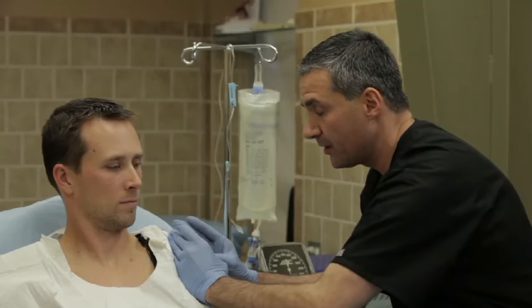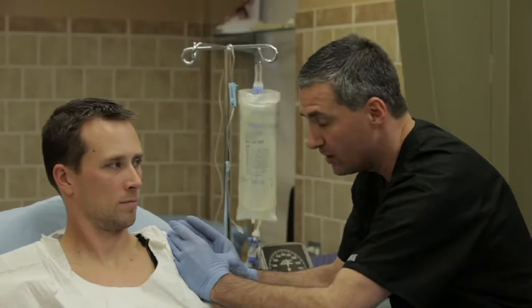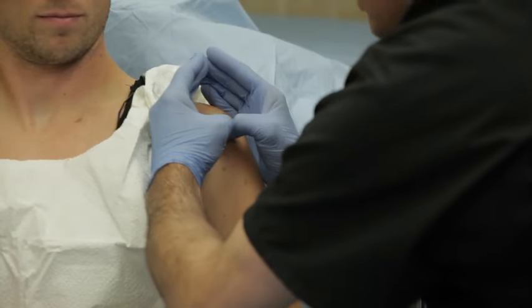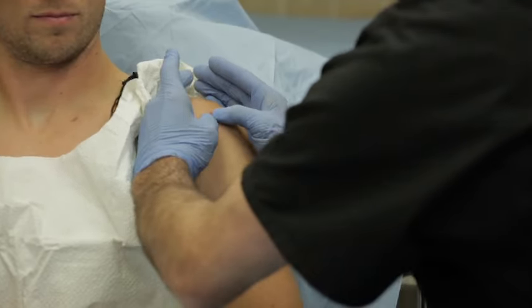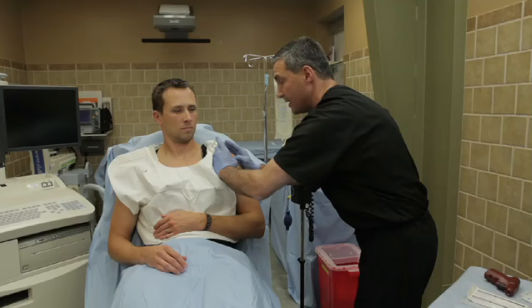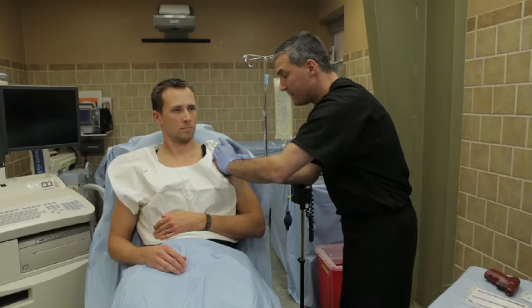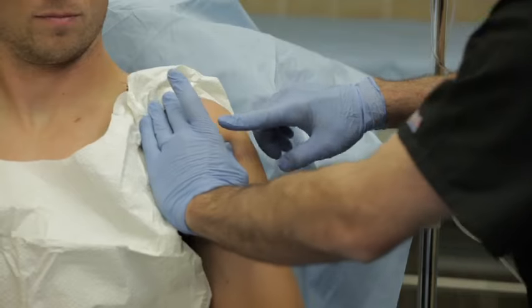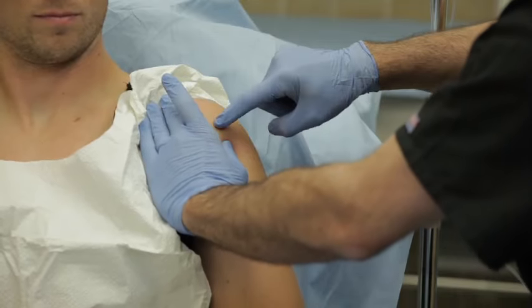The proper target is about one or two centimeters — or one finger breadth — above the surgical neck. Palpating up and down, you will feel for the surgical neck. It will feel like a golf ball on a tee. Where the golf ball meets the tee, that's the surgical neck, and the proper placement is approximately one or two centimeters or one finger breadth above that.